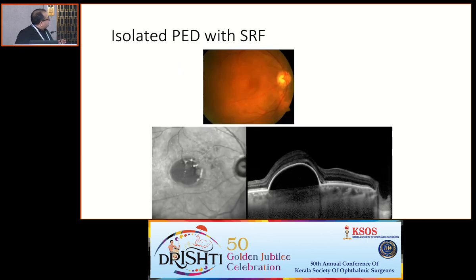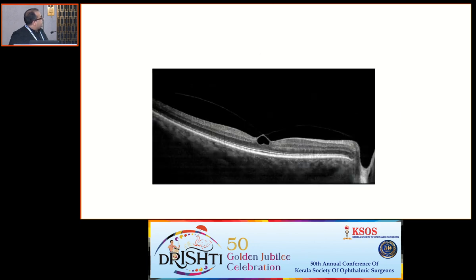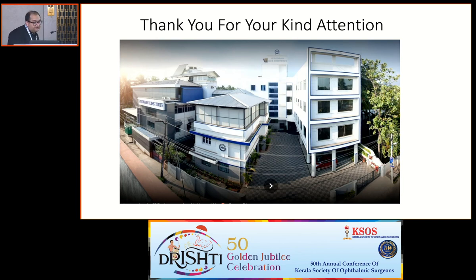A CSR, this is how it looks. Isolated serous PED and serous fluid pockets in VKH. Look long enough into the OCT, you will actually fall in love with it. Thank you very much for your kind attention.